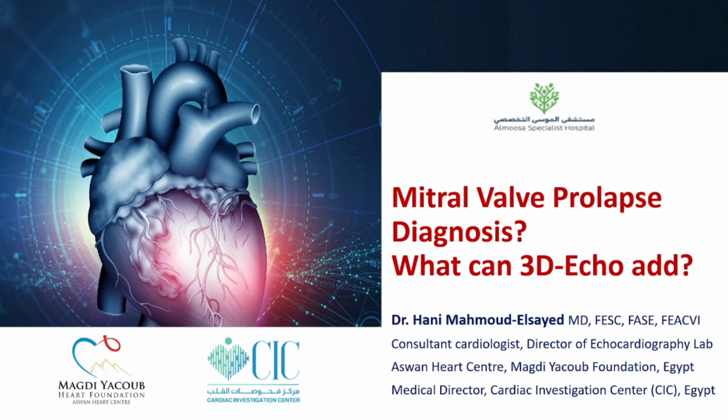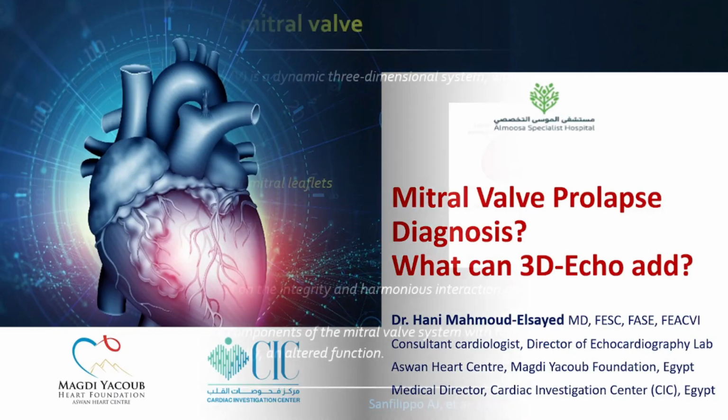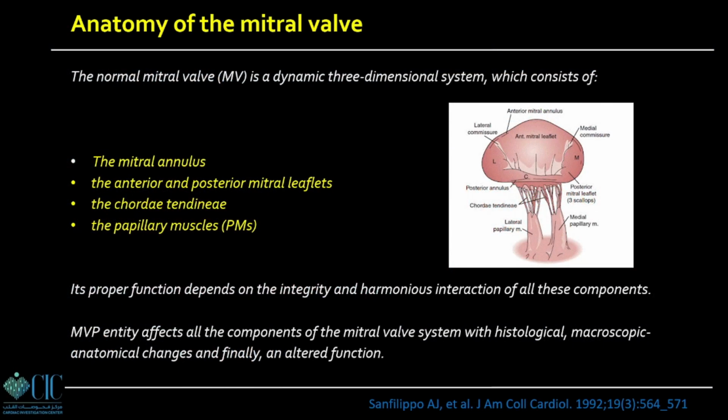I will be speaking about mitral valve prolapse, the diagnosis, which can be basic for some of you, of course, and the added value of 3D echocardiography. Mitral valve, to start, is not about the leaflets. Mitral valve is an apparatus.